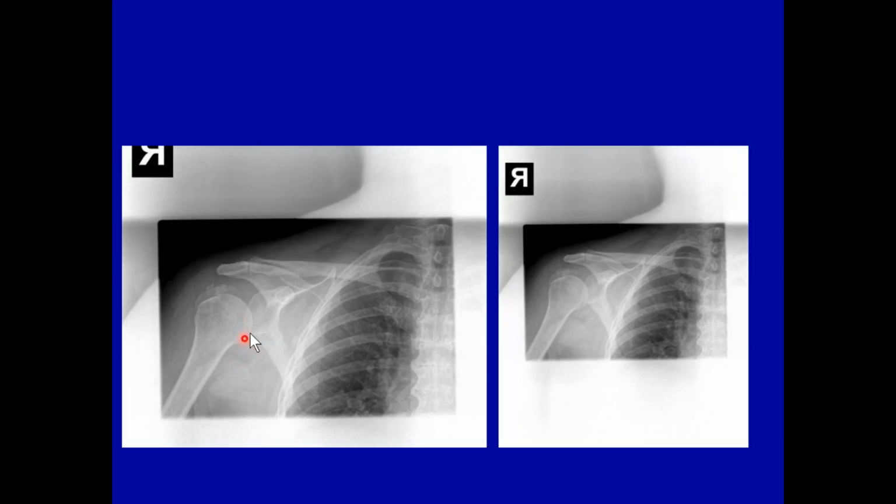x-ray, we're seeing calcification where there shouldn't be calcification, so I can make a report to the doctor and say there's calcification in the subdeltoid bursa and your patient likely needs an orthopedist intervention, and they'll usually stick a needle in there and remove the calcific density.